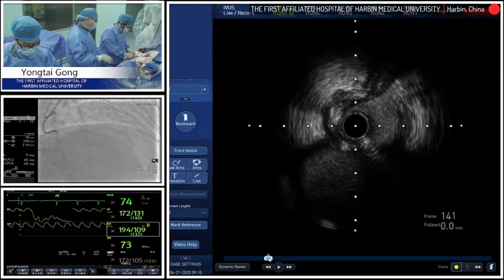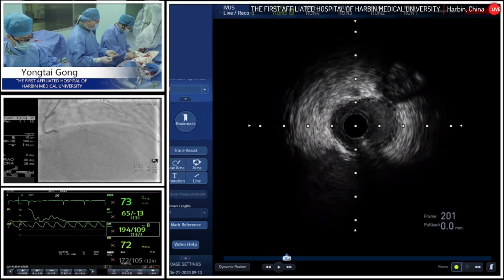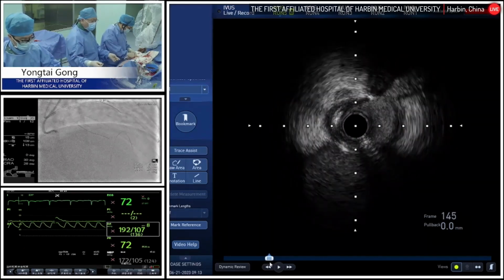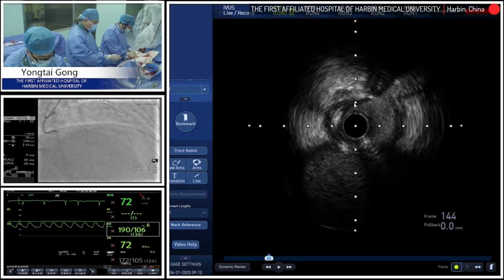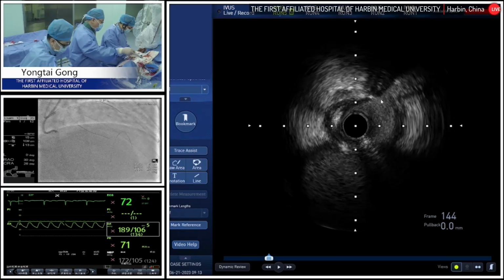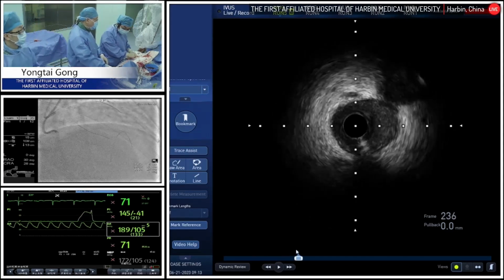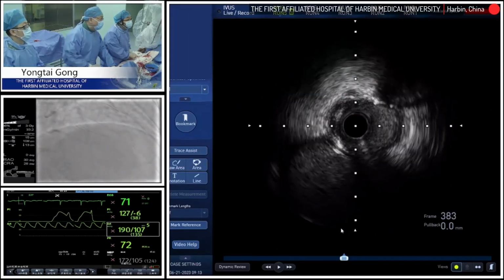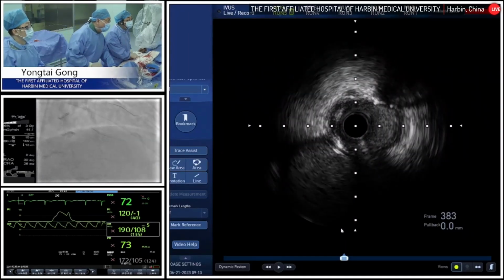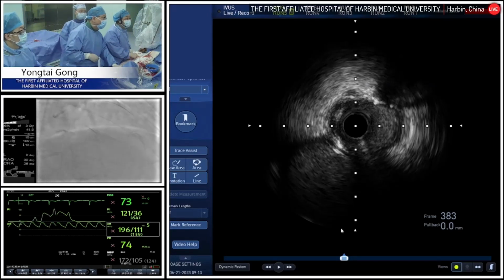It's relatively high risk from antegrade of going into the subintimal space, because we can see that this entry point is very close to the intima, and there is also a very sharp and tortuous angle of the proximal LAD. This is high risk from the antegrade. Even if we try the antegrade approach later, I think that bilateral angiography and also the dual lumen microcatheter are of key importance in this patient.